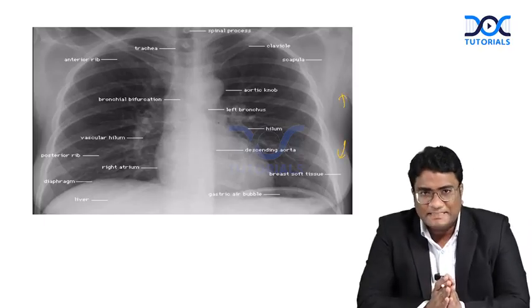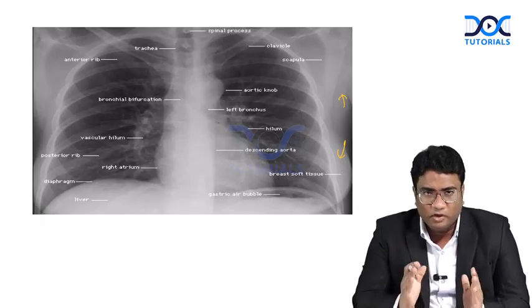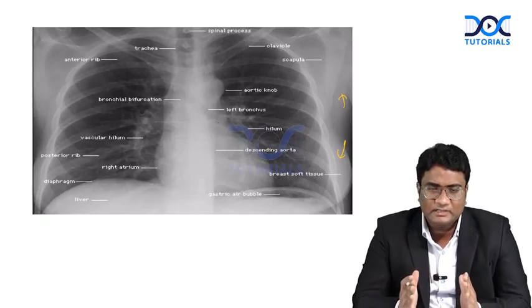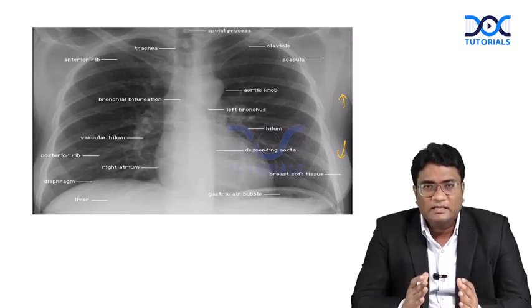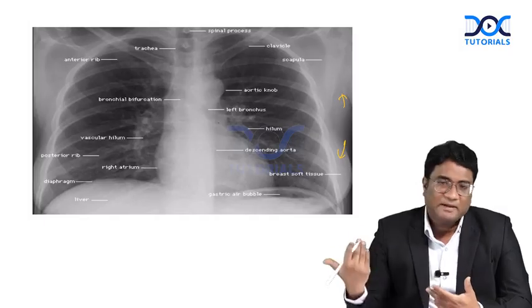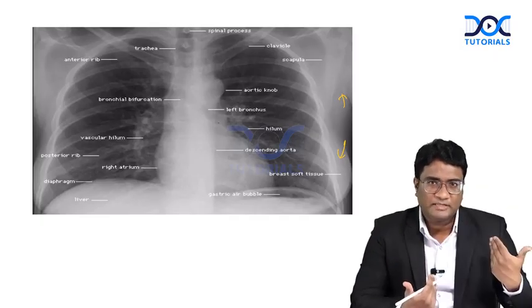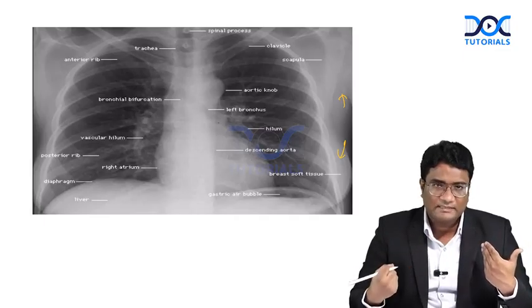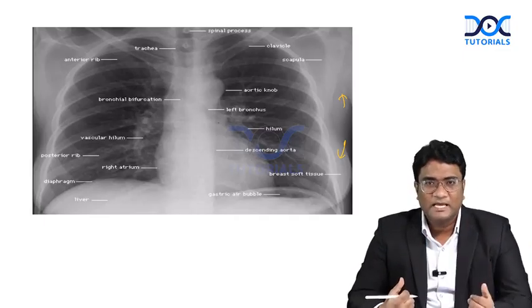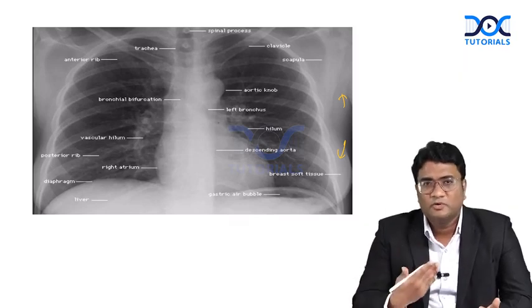So this is what is called as inside out approach. Let's do this once again. Whenever you hold a chest radiograph, look at the inside, look at the trachea. Is it displaced to any side? Is it displaced to the same side of the opacity or opposite side of the opacity? If there is a volume gain like a massive pneumothorax or a massive pleural effusion, the trachea will shift to opposite side. If there is volume loss like in collapse or atelectasis, the trachea shifts to same side. And in pneumonia or consolidation, there is no net change in volume, so there is no tracheal shift.